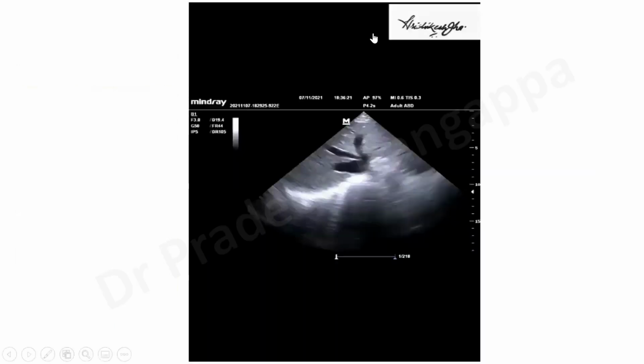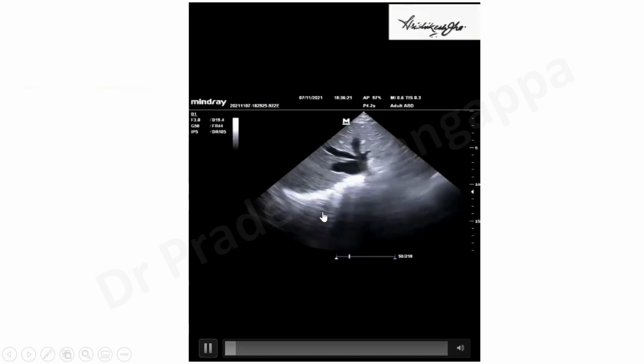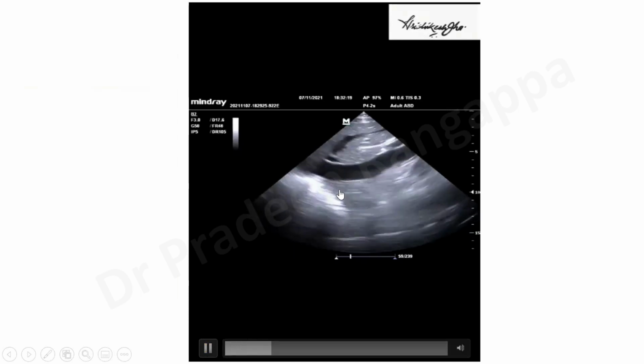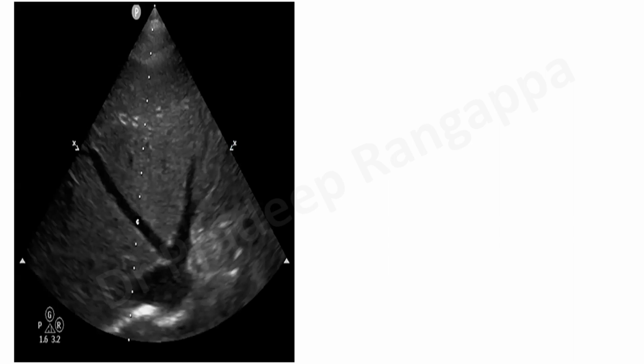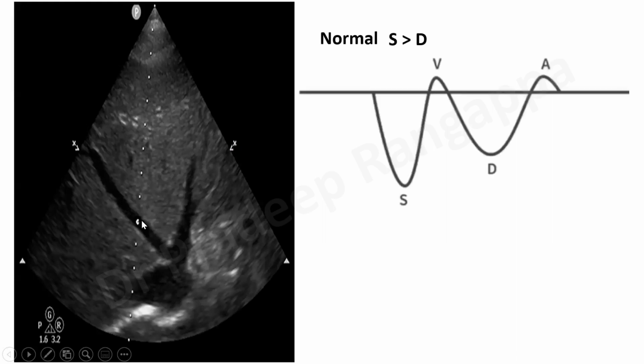So this is again a courtesy image by Rishikesh, where he has sent me this nice video where you can see this bunny video. So you can see that is how the left hepatic vein, the middle hepatic vein, and the right hepatic vein look. And then he has put in other videos. We'll discuss about it subsequently. So this is how the bunny sign looks. So you place the cursor, insonate it, and you put a pulse wave Doppler.